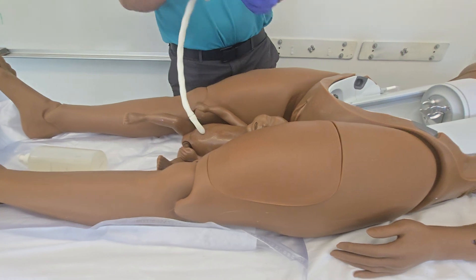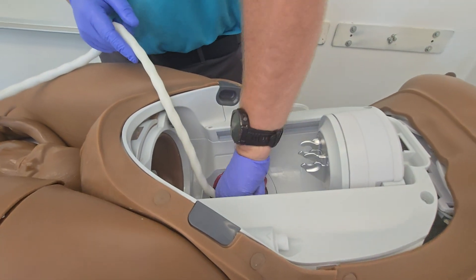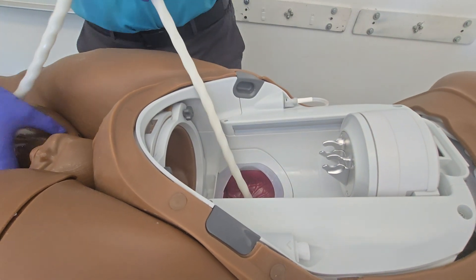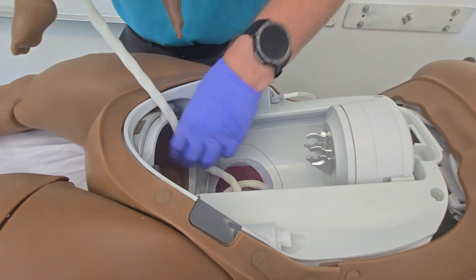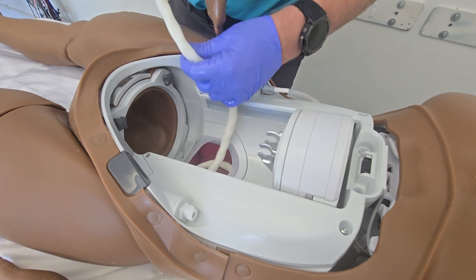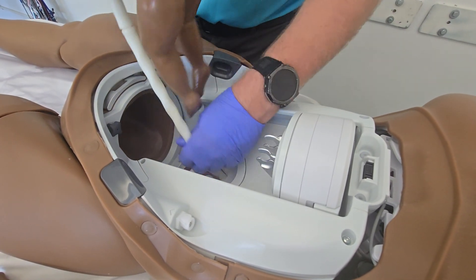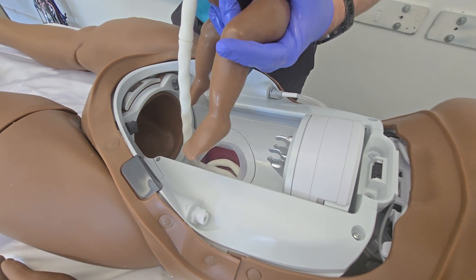We'll start by inserting the placenta into the pocket — it just goes in like so at the bottom. Once the placenta is in, we're going to fit as much of the umbilical cord in there as possible as well. It doesn't have to be all of it. You can also do umbilical cord wrapping around the baby — that won't affect the delivery; it would be something the students would examine when the baby's being delivered.